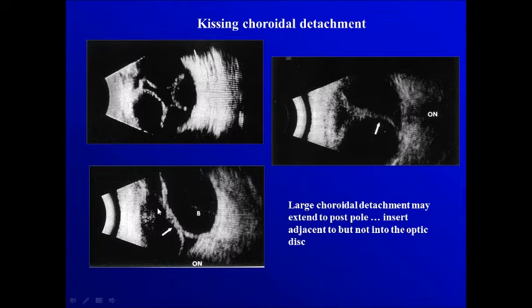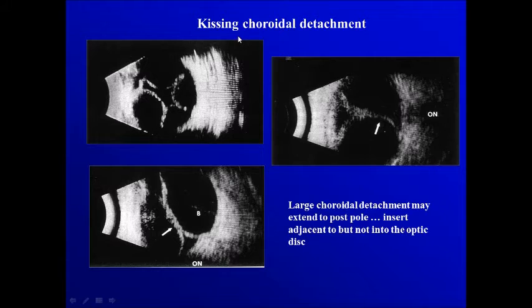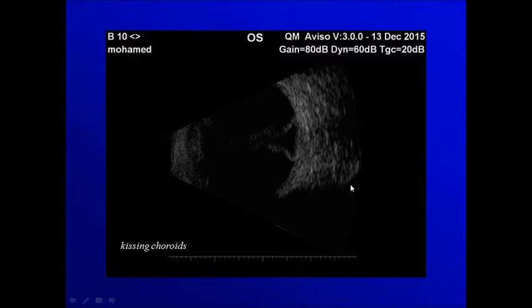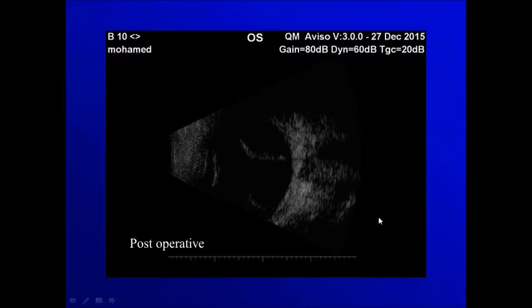Sometimes we have a huge choroidal detachment so that the detachments touch each other from one side and the opposite side. This is a serious condition and needs to be dealt with surgically. In this example, we get a kissing choroid from this side and that side, and after intervention the two sides became separated.